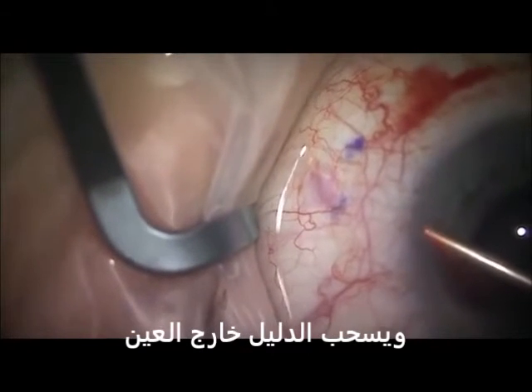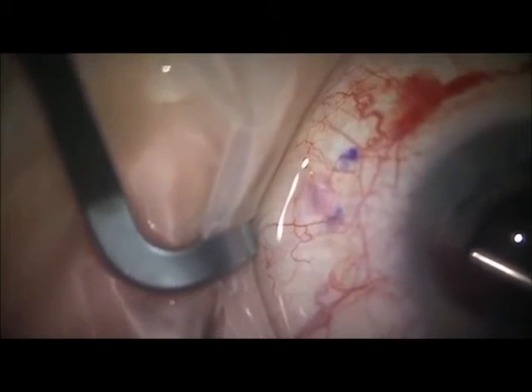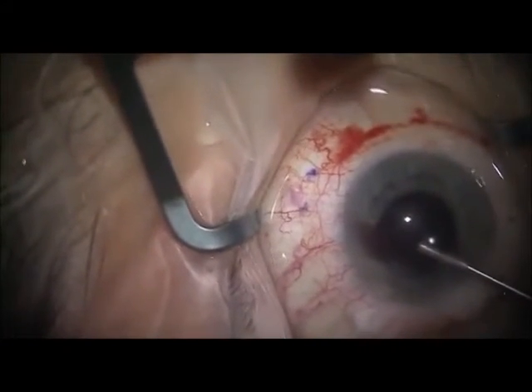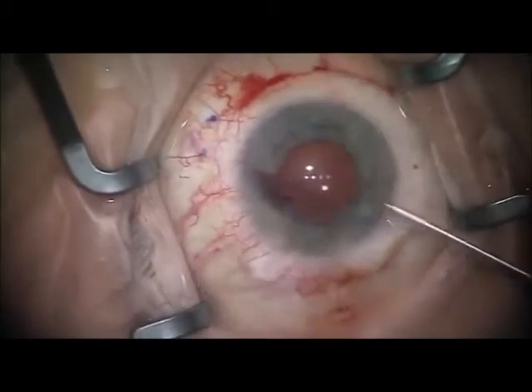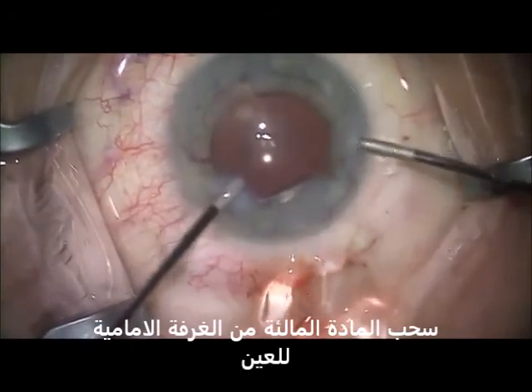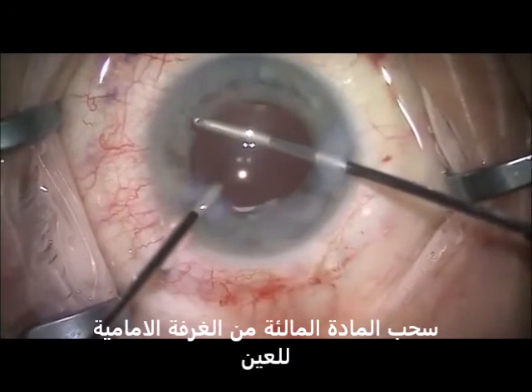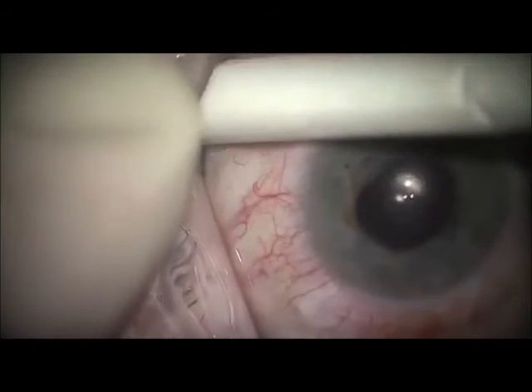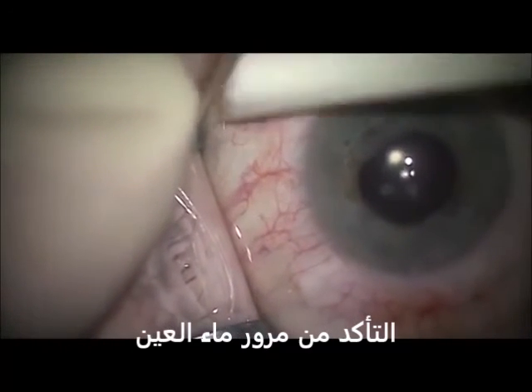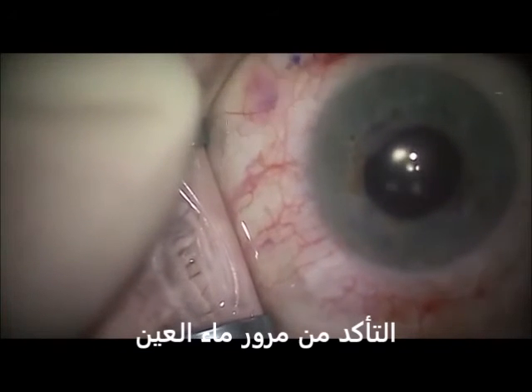The implant swells, which prevents it from migrating from the original position it was placed in. Aqueous humor will begin to flow, creating a low-lying bleb. Remove OVD from the anterior chamber to allow full aqueous flow. The Zen gel stent is delivered into the non-dissected tenons, creating a connection from the anterior chamber to the sub-conjunctival space.